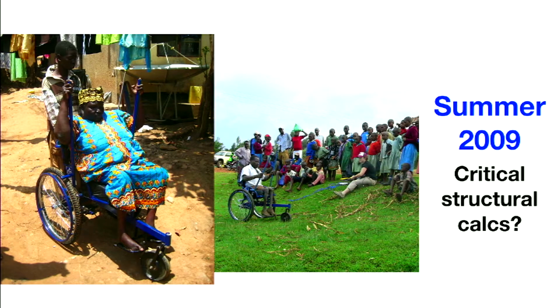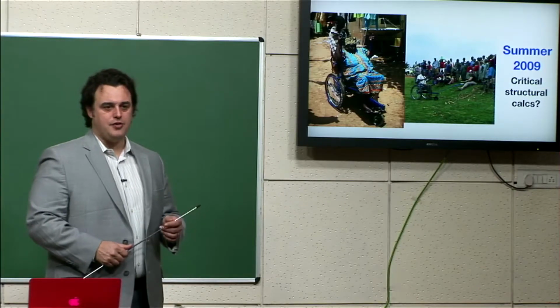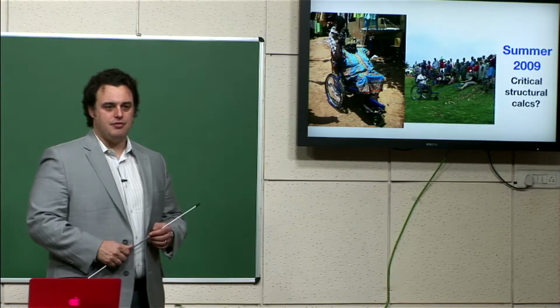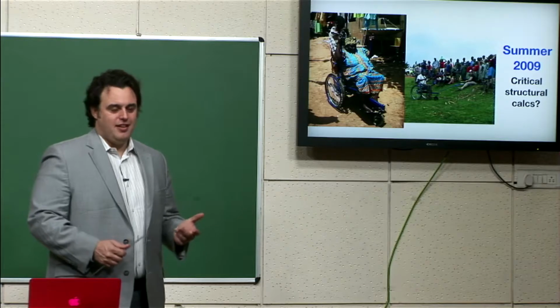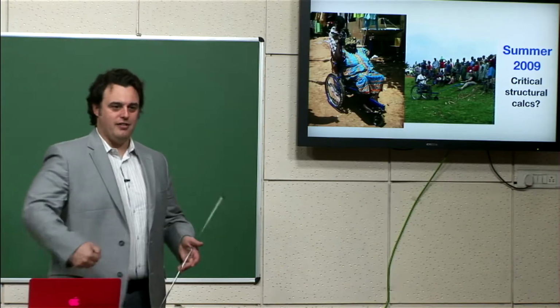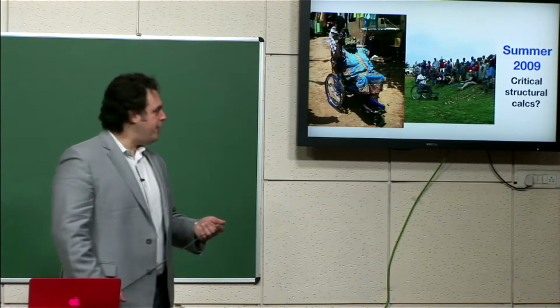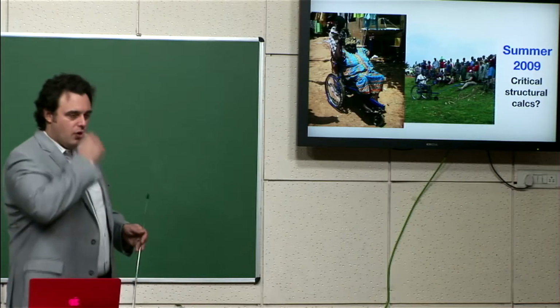Well, that's a good point. I already told you that you have the highest loads in the chain. Let's say you shear a tooth off the chain ring, or your chain falls off. What happens to the user? Nothing, right? They're fine. It just turns into a regular wheelchair. They just grab the push rim. So no big deal. Yeah, seat failure is one interesting one.